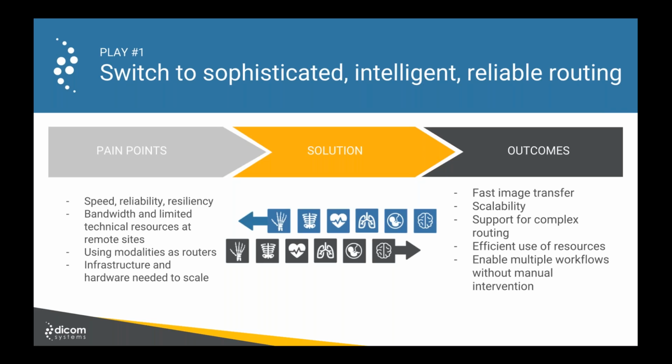Many of our community hospitals are in areas in which connectivity is not prevalent. So we struggle at times getting good bandwidth from our client sites, and how can we route the right studies across the most urgent cases first was an important factor. So prioritization was important, such that we got the most urgent cases first.